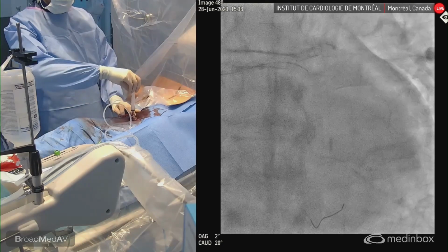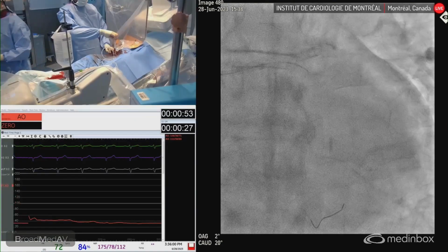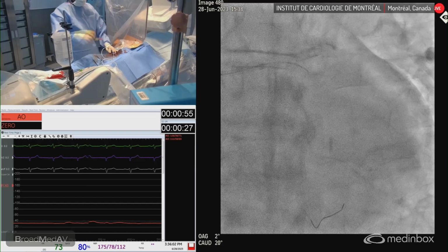So do you plan a balloon after that? Or no, I think we would stent. We're already pre-dilated. Okay.